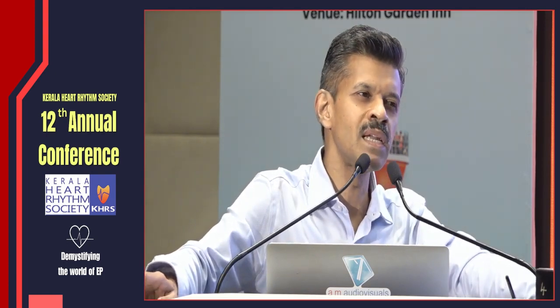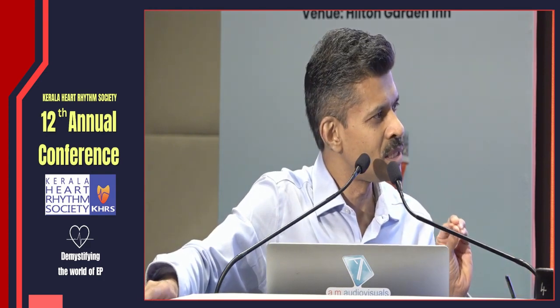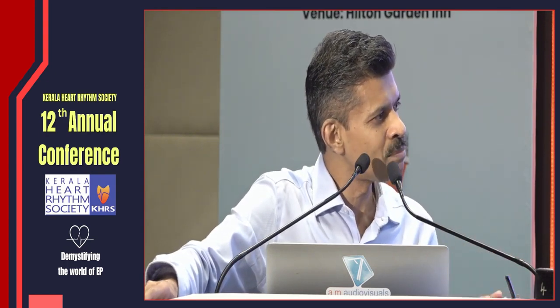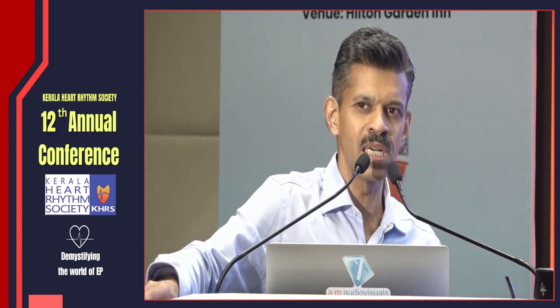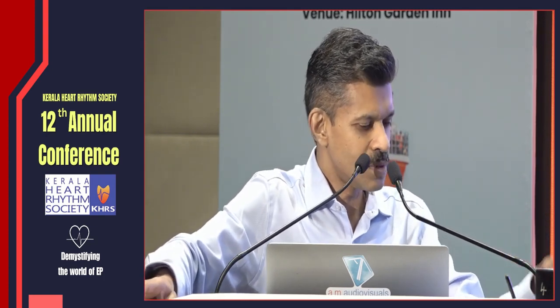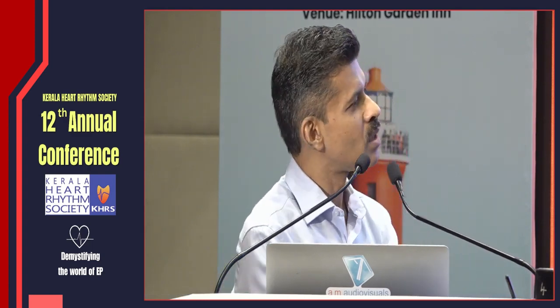The other thing is to make the patient really comfortable. It is extremely important. The moment the patient is tense, sinus rates increase and the PVC doesn't come. So talk to the patient and calm the patient down the moment he is taken into the lab. Do not sedate the patient. Minimize the amount of local anesthesia infiltrated in the groin. I still believe that it can get absorbed and suppress the PVCs. But the very important thing is to have a very relaxed patient.